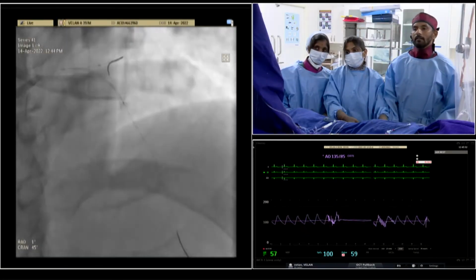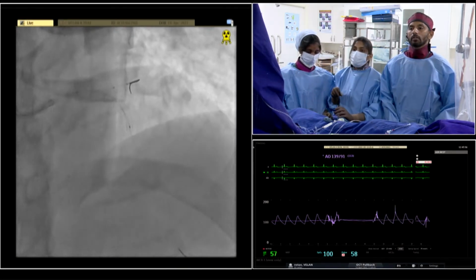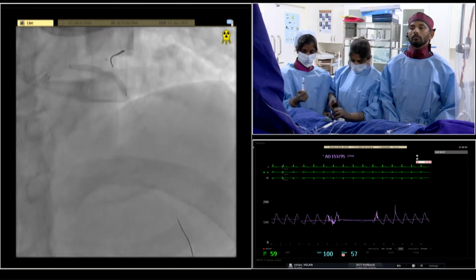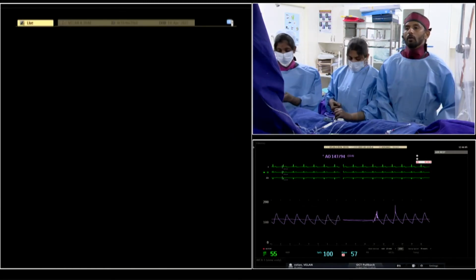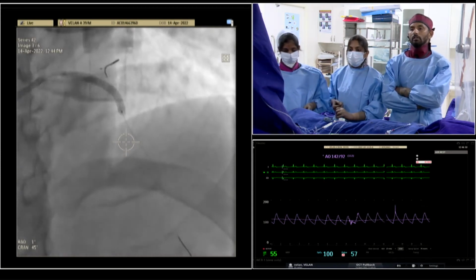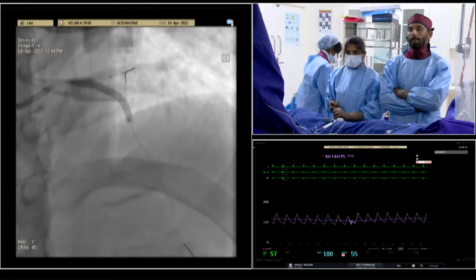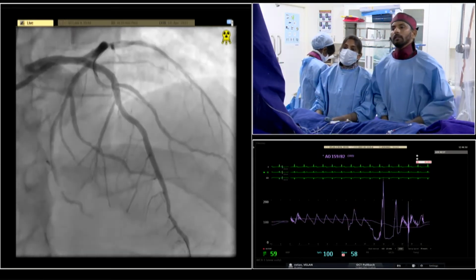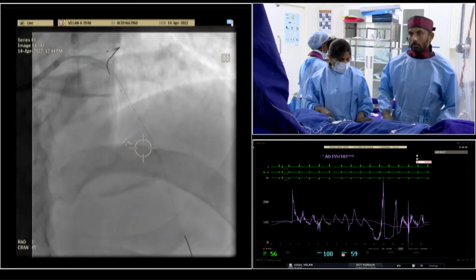So what I've done is I've just pulled the stent balloon back 2 millimeter, and to go at a little high pressure, go up there. 10, 12, 14. That's enough. So we're just optimizing the ostium of the proximal part of the stent before we crush with the circumflex balloon. And down. Yeah. It's exactly what I wanted the LAD stent to be.